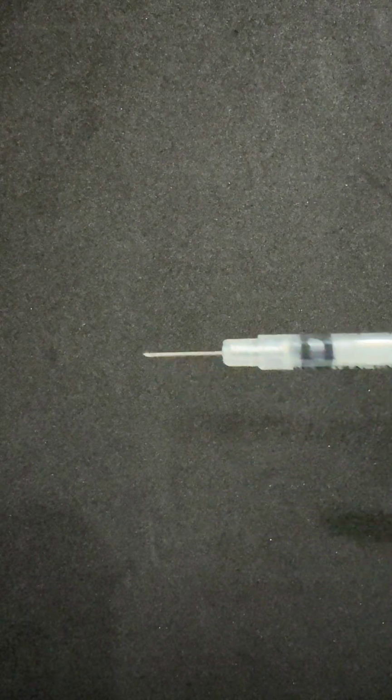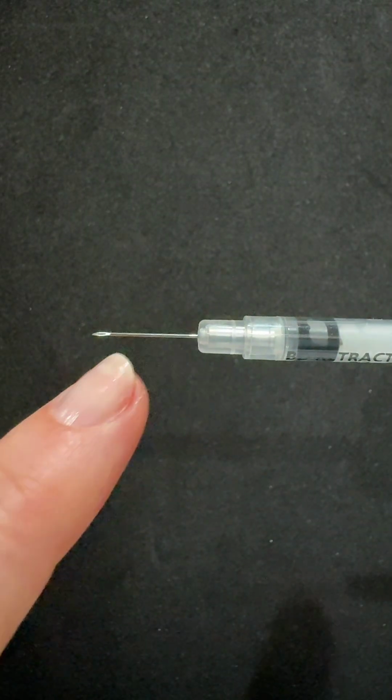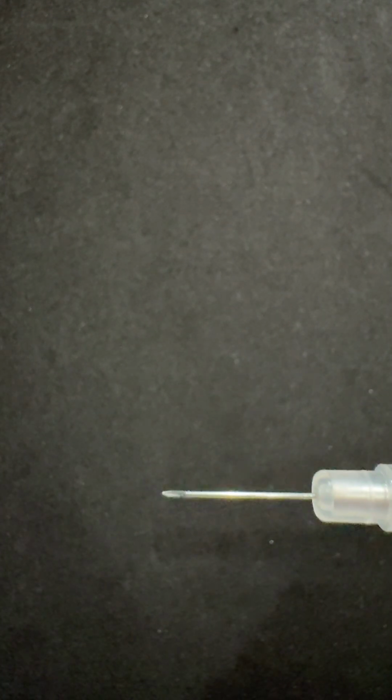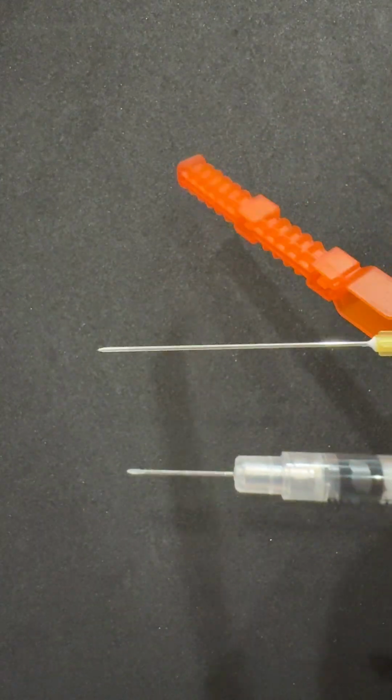When we pick our needle lengths, I'm going to show you a few different needle lengths. This one is a 25 gauge. That refers to the thickness of the needle. I'm going to show you a comparison. Let's look at, I pulled this needle out.